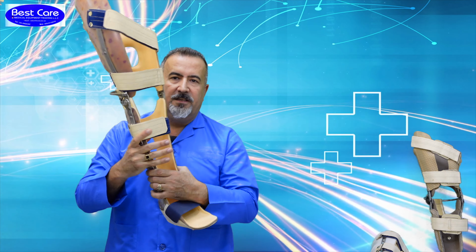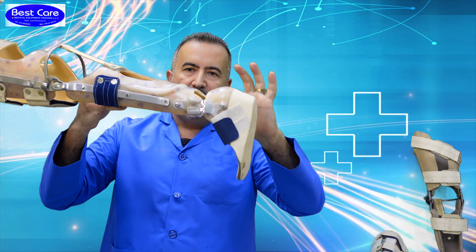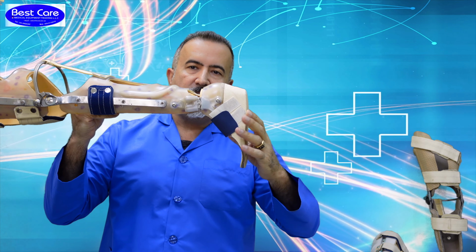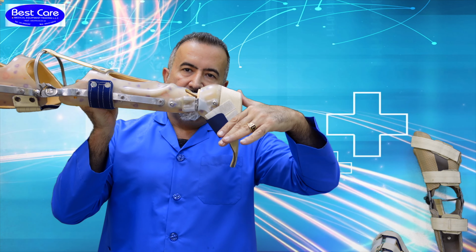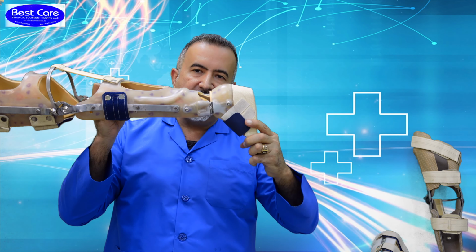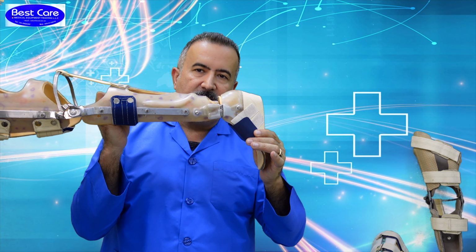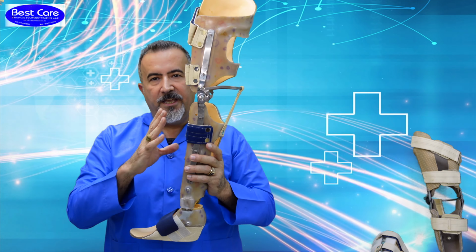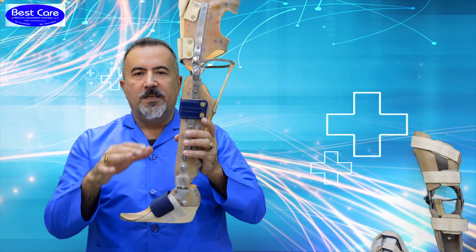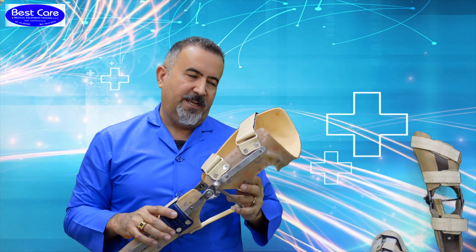The next one, again, we used the same joint, but there we have used a joint for the ankle, which is giving plantar flexion, but the movement is very stable, and the material for the joint is titanium. Again, all the components, the bars, the joint, also here are from Ottobock Germany.